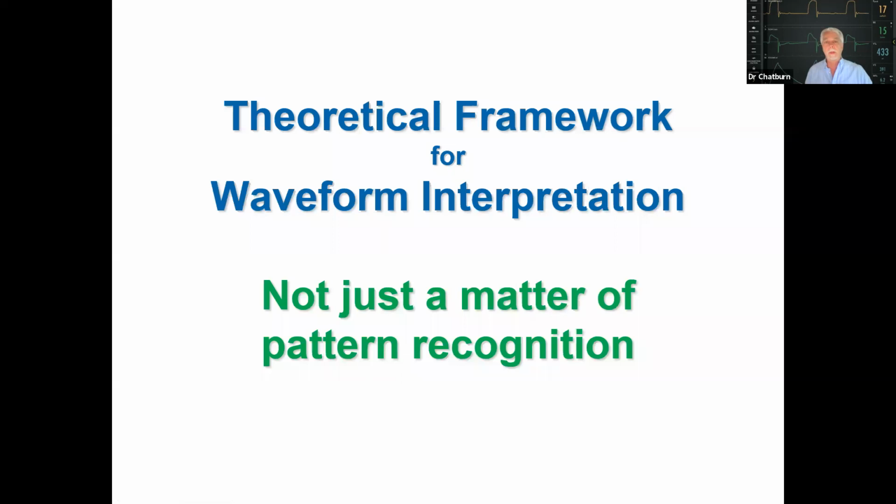Now, let's talk about the theoretical framework for waveform interpretation. Unfortunately, the way waveform interpretation is often taught is just a matter of pattern recognition. In other words, someone will show you a waveform and say, well, this is reverse triggering, and every time you see that, that's what it is. And it just comes down to memorization, which doesn't really lend itself to you understanding much about what's going on in terms of patient-ventilator interaction.